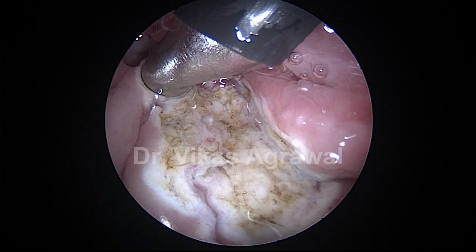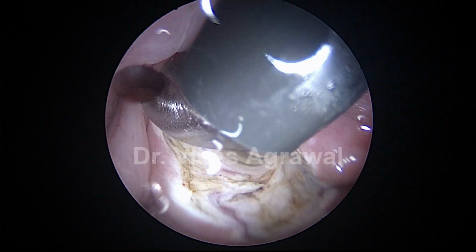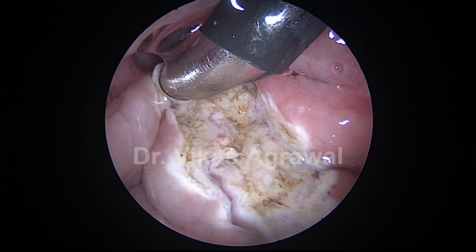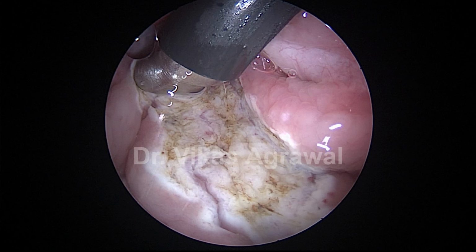That's the torus tubarius. So I'll remain away from the eustachian tube and only take away the superior part.